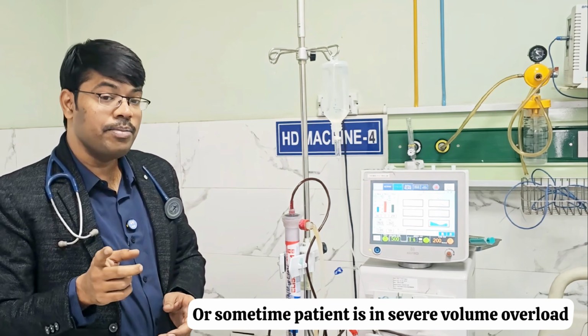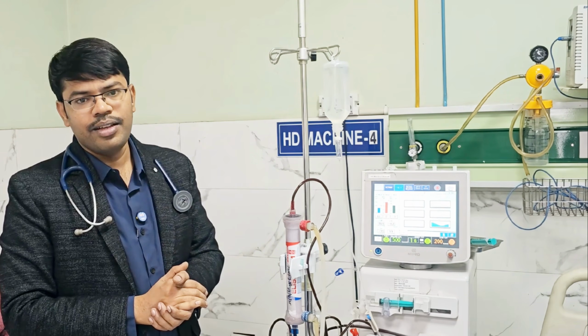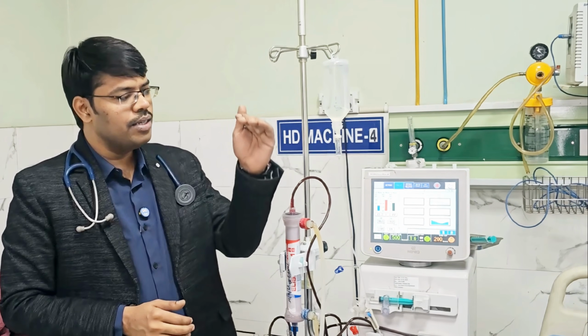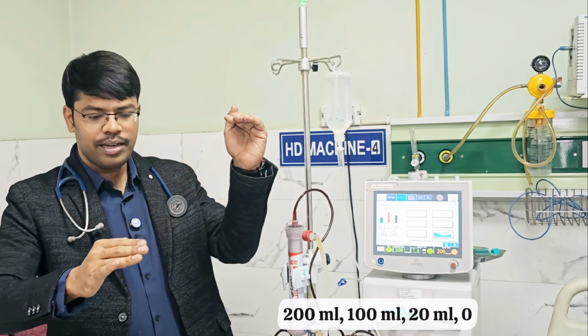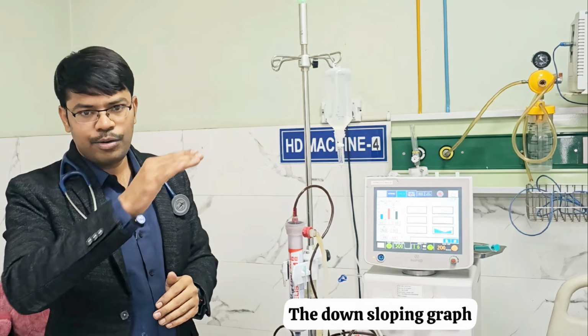Or sometimes patient is in severe volume overload. In the beginning only you want to remove more. So in the beginning, to start with, in the first hour you want to remove more. Let us take 1 liter you want to remove. So the graph, the initial 20 minutes you will remove more, 400 ml, 300 ml, 200 ml, 100 ml, 20 ml, 0. So the graph will come like this, the down sloping graph.